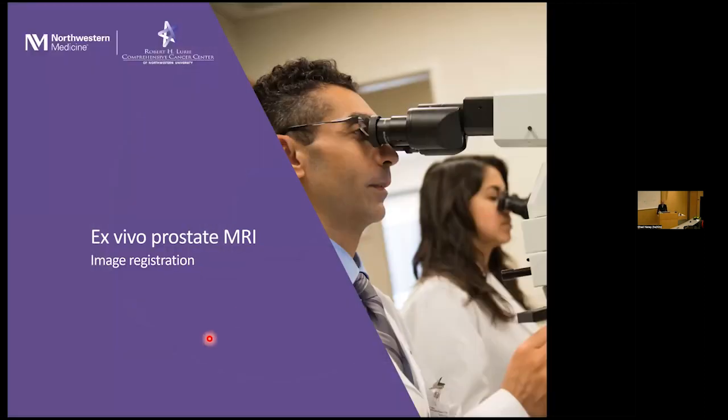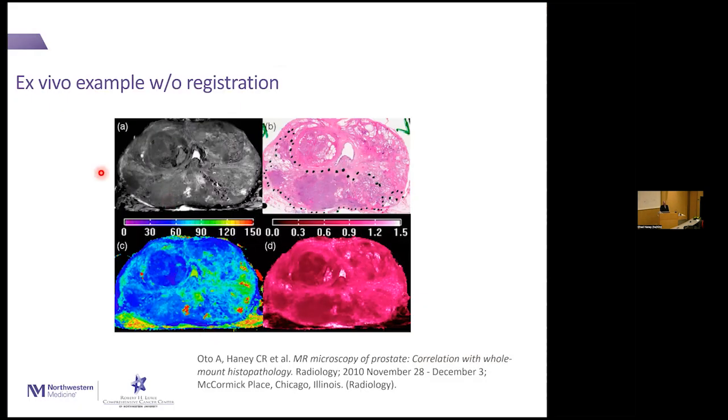So this is now, I told you they do all the clinical work at CTI. This is an example from University of Chicago when I was there, where this is human prostate. We decided to use the ex vivo prostate in our 9.4T because of the difference in resolution. We were trying to look for smaller features that you wouldn't be able to see with a clinical scanner. So a clinical scanner is typically on the order of, say, 1 millimeter, half millimeter, something like that, whereas the preclinical scanner can do 100 micron resolution.